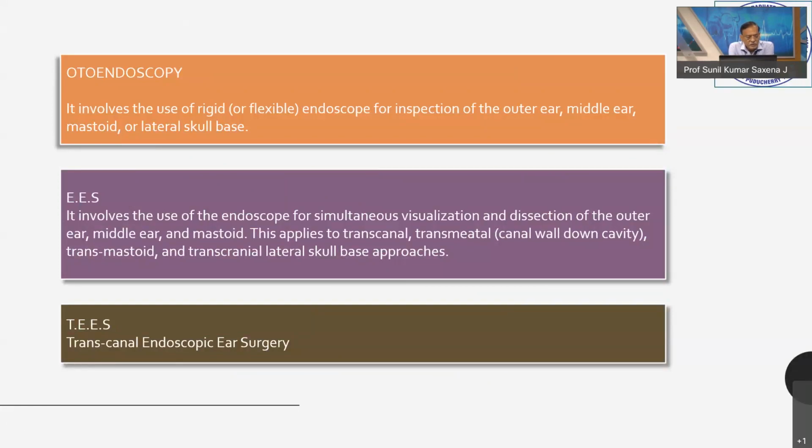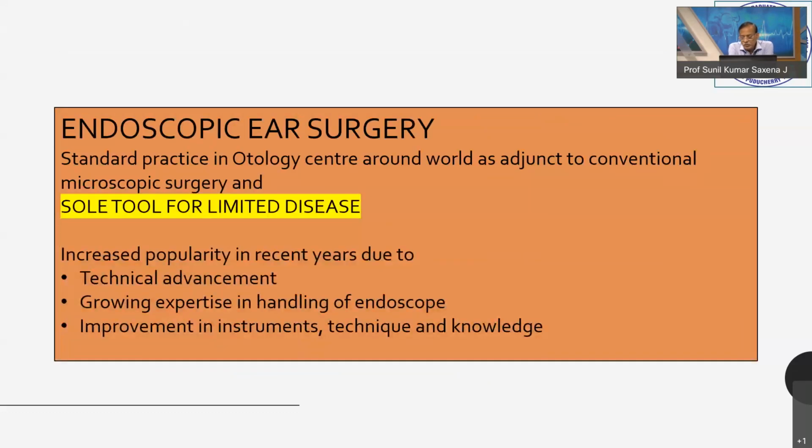Then one more recent term is transcanal endoscopic ear surgery, in which the surgery is done totally through the ear, the external auditory canal. In recent years, endoscopic ear surgery has gained popularity, and it has become standard practice in otology centers around the world as an adjunct to conventional microscopic surgery. And it is the sole tool for limited disease.